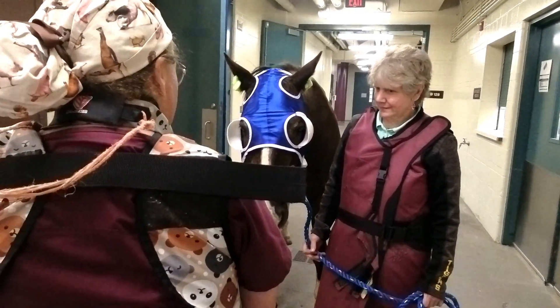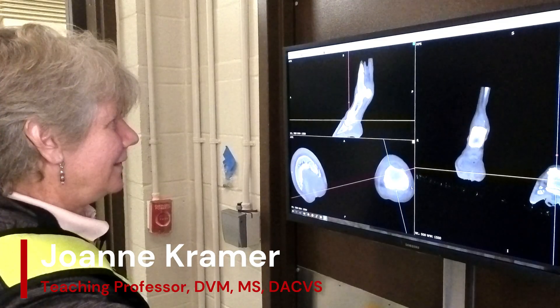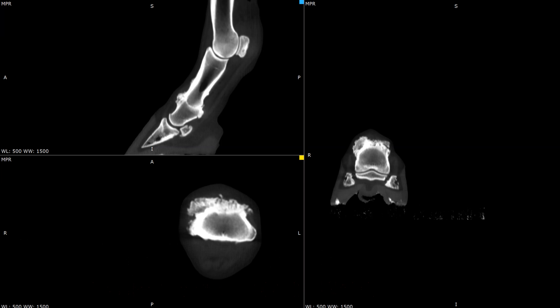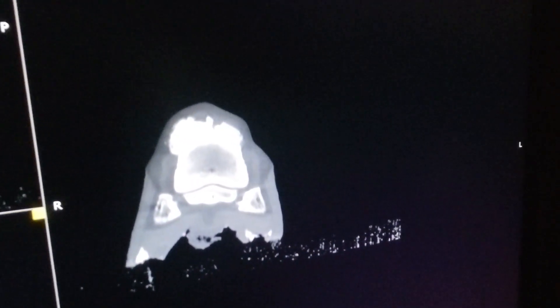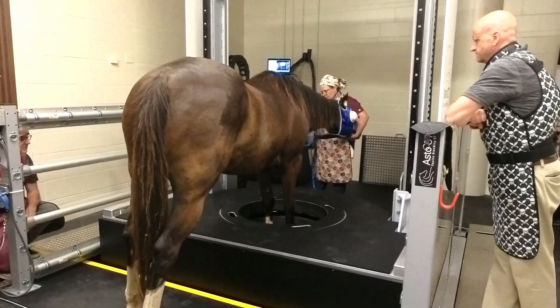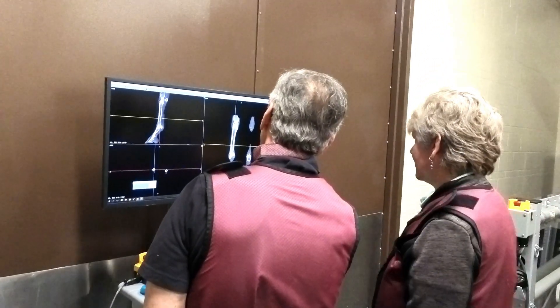We are looking at pretty extensive arthritis here in the pastern joint. We've got the long pastern bone and the short pastern bone, and then a lot of new bone that's trying to lock together the joints. You can see all this extensive bone reaction on the dorsal surface of it. That's all the body's attempt to fuse or lock these two bones together so that they can function as one bone rather than two small bones.